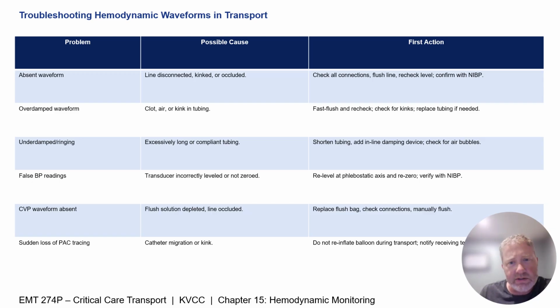So having a systematic check of the entire monitoring chain prevents inappropriate treatment based on false readings. This is particularly important in transport, where a faulty invasive pressure reading can easily trigger the wrong vasopressor or the wrong fluid decision. Verification with non-invasive measurements and the overall clinical picture is absolutely essential.